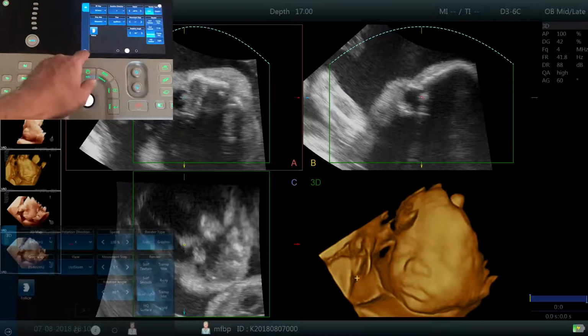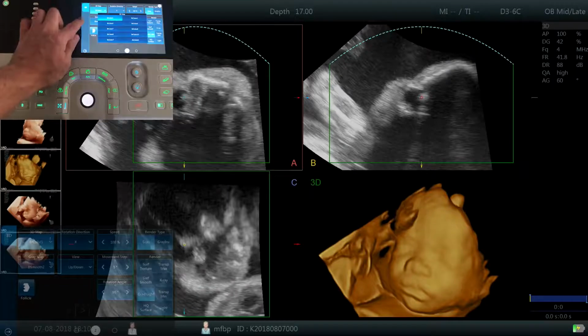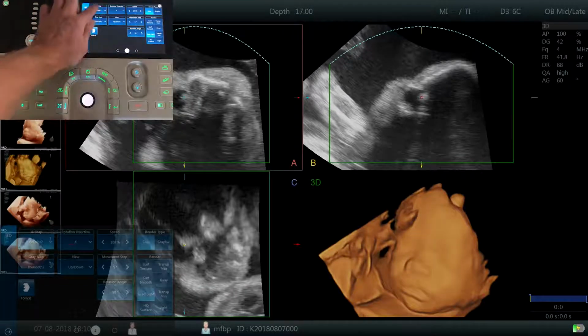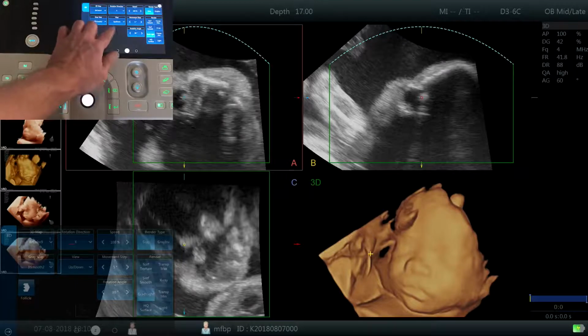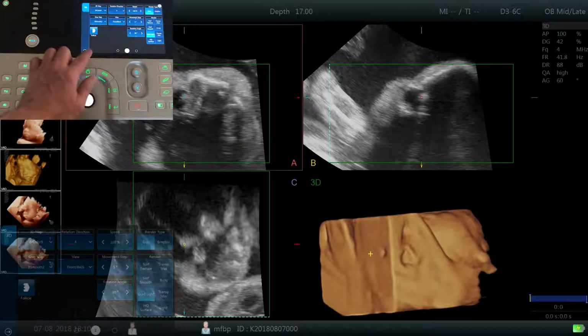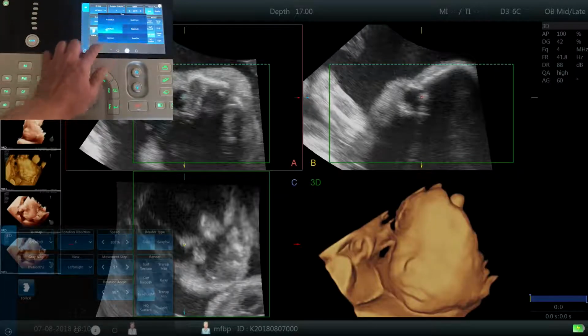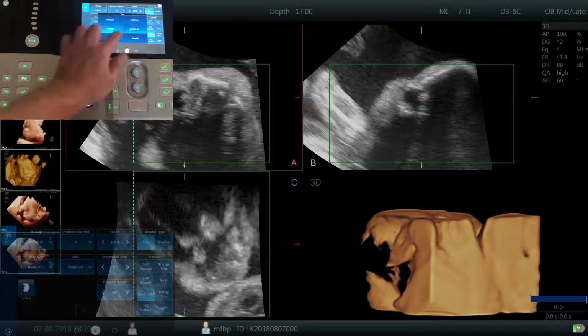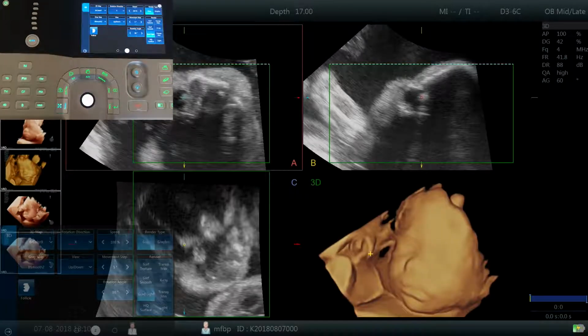So going back to this screen, we have some options to change the colour. B colour 7, B colour 9. You just get a slightly different appearance on the 3D rendering here. That's what we're getting there. The view up down, I'll show you what that does. We don't touch this because it just basically renders the 3D upside down, back to front, left to right, which just makes things more difficult. So we leave that on up down.